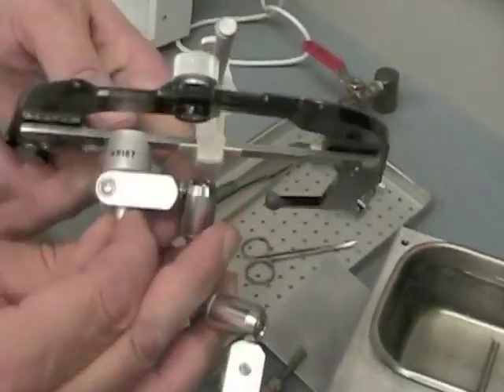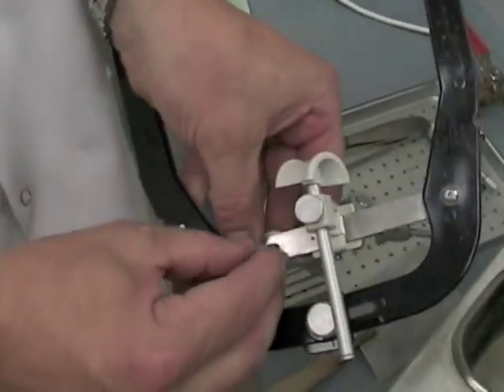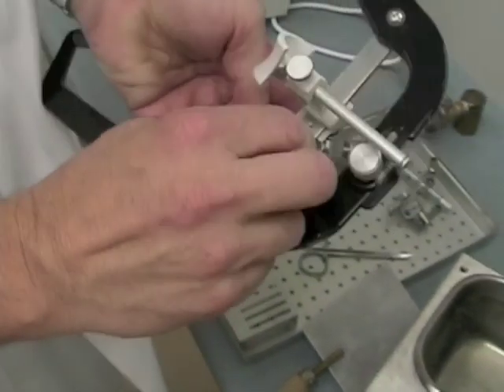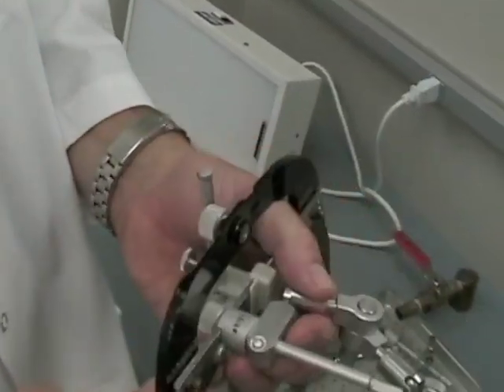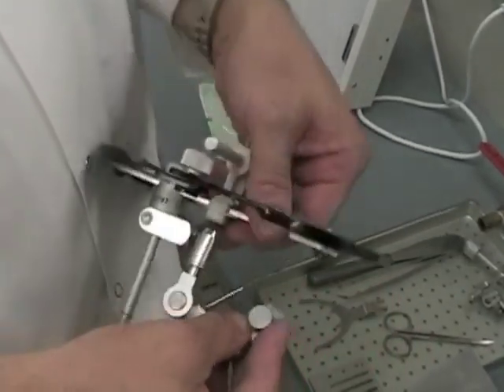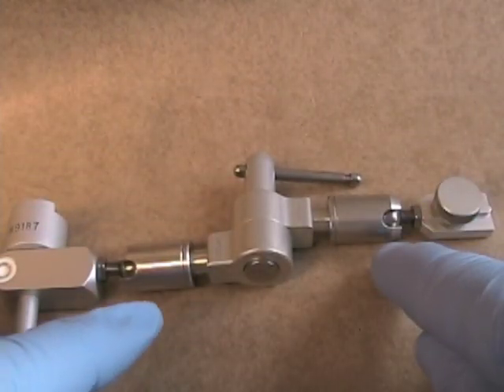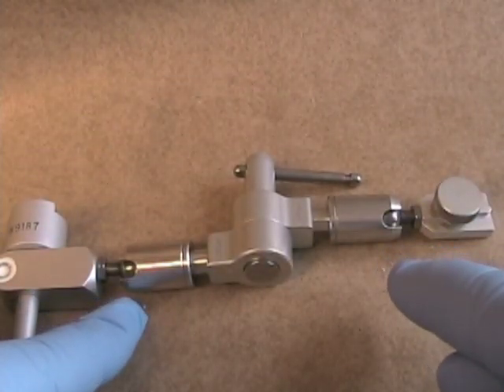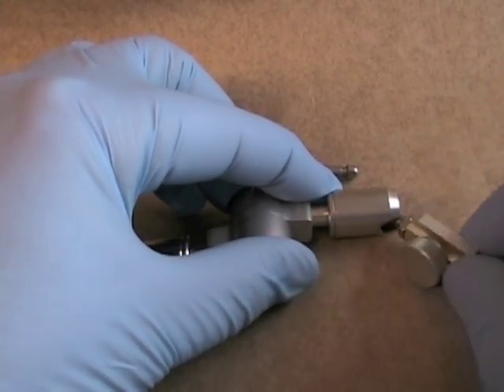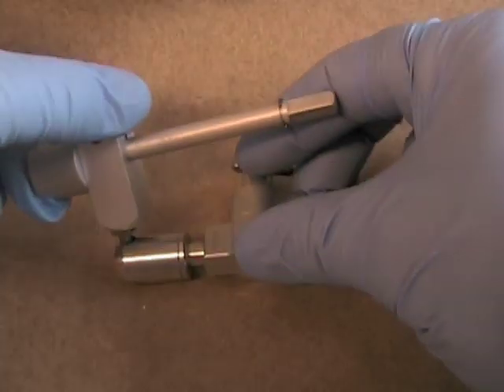To make a face bow transfer using the Whitmix face bow, first put the quick lock toggle assembly on the opposite side of the nasion support and tighten that with the thumb screw. Make sure that the quick lock toggle assembly is facing downwards and that your universal joints rotate freely. It's important at the two junctures on the quick lock toggle assembly that when you make the bend for those particular parts, it bends in the slot in the side of the quick lock toggle assembly.